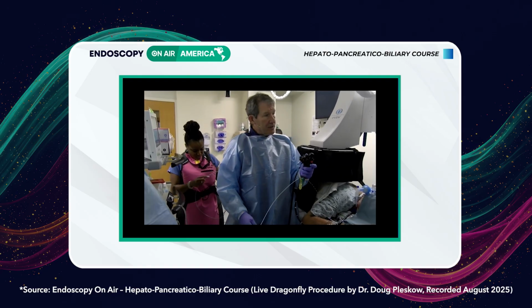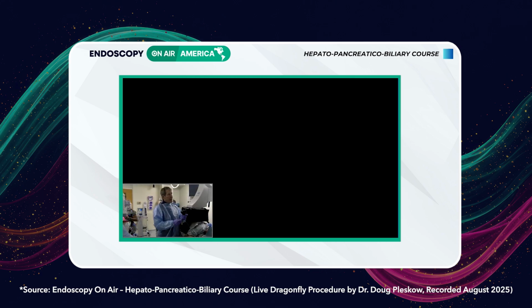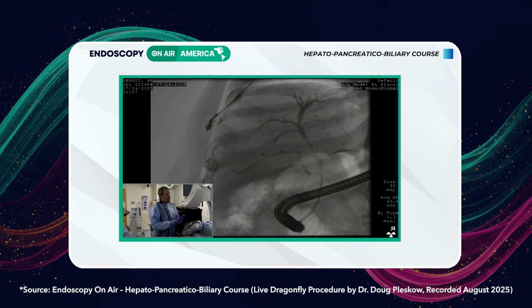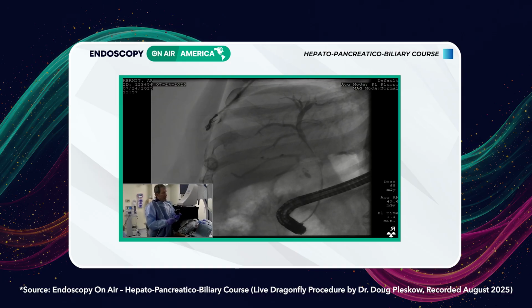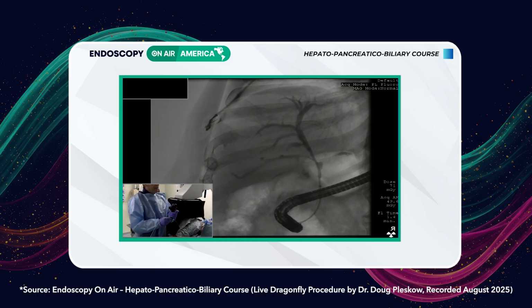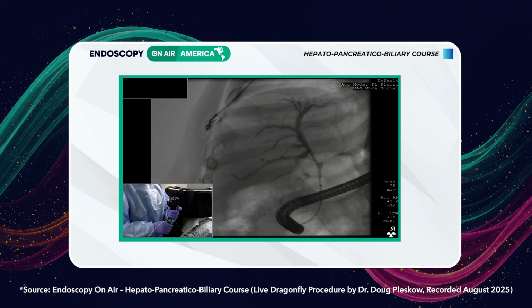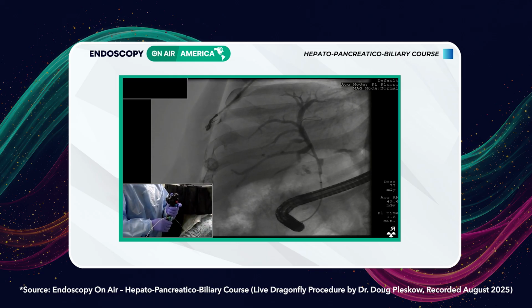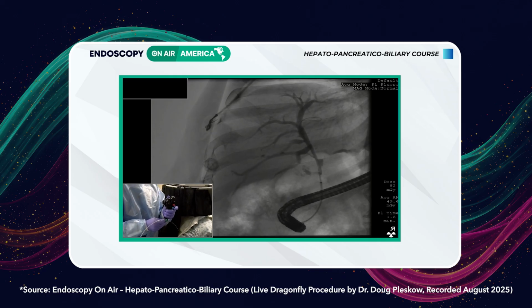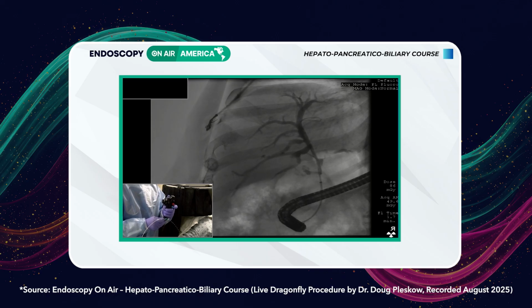So we've already taken out our stent, and I want to show you the cholangiogram. If we can go to the fluoro image, please. We have the cholangiogram here, and we're going to inflate the balloon, G, and inject a little bit more contrast. And here you can see at the takeoff of the left system, there's what appears to be some obstruction. On the prior cholangiogram that we saw, it looks somewhat mass-like versus even a square stone.